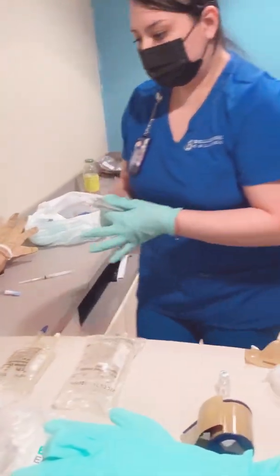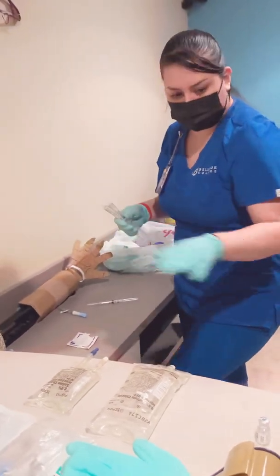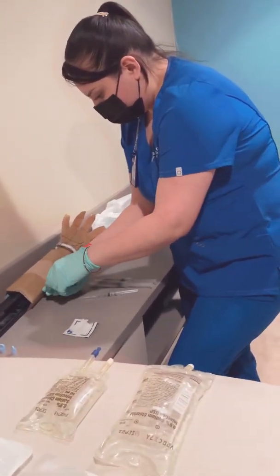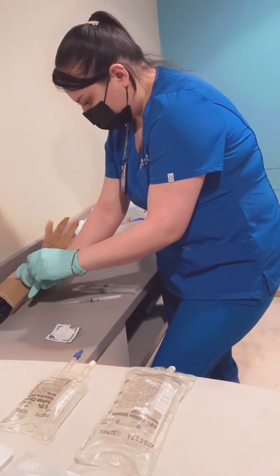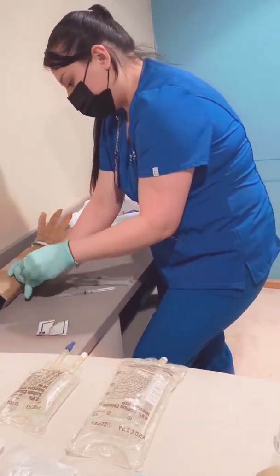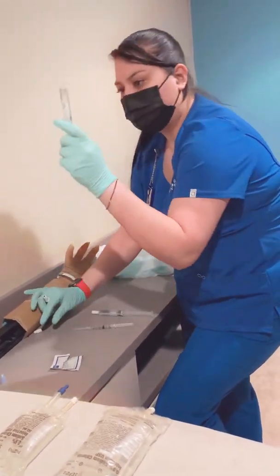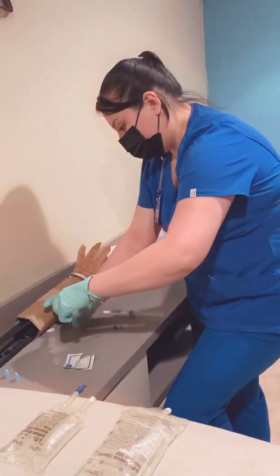Okay, so I'm going to need normal saline and alcohol swabs and some hubs. So I'm going to start off with clamping my IV site. Put it in between my non-dominant fingers. And I'm going to swab the hub for 30 seconds with an alcohol wipe. Grab my normal saline syringe. And I'm going to attach it to the hub, sterile technique.